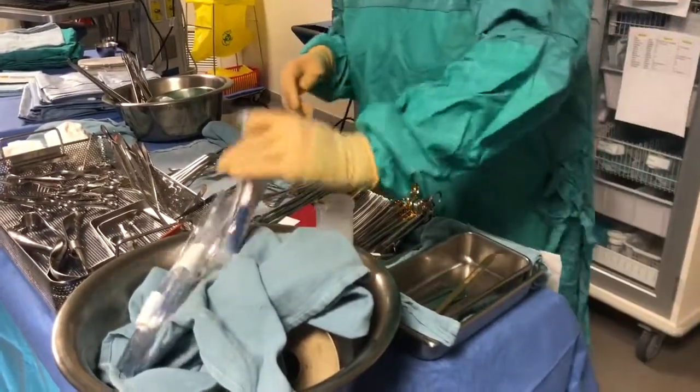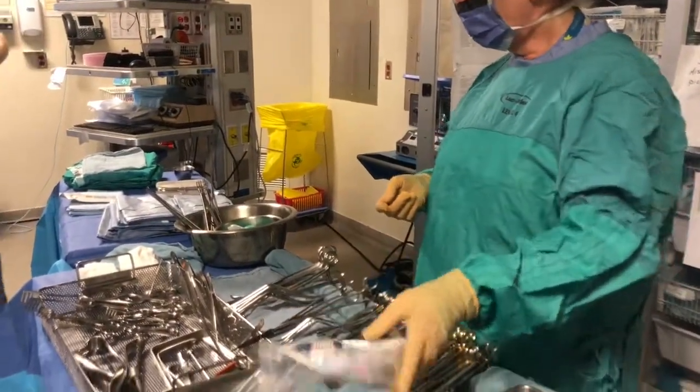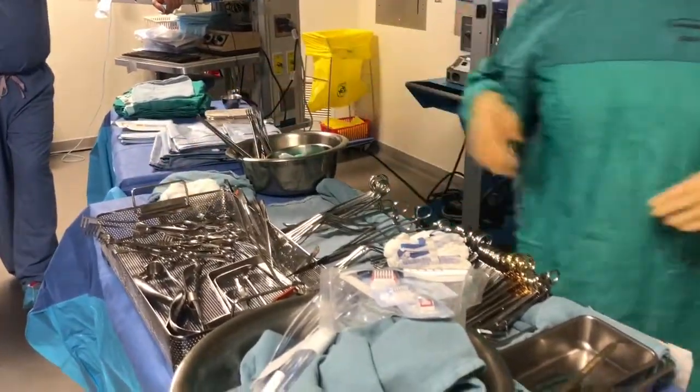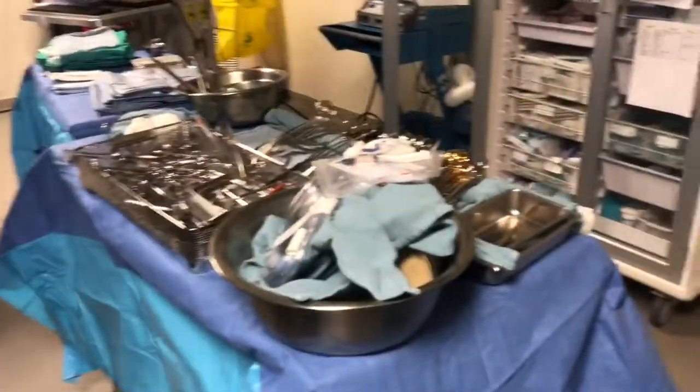So for an aorta, I would open up my pack and I'd be ready to count. Okay. So counting. If we have a count sheet, I'd like to get a count sheet. Let's see that.